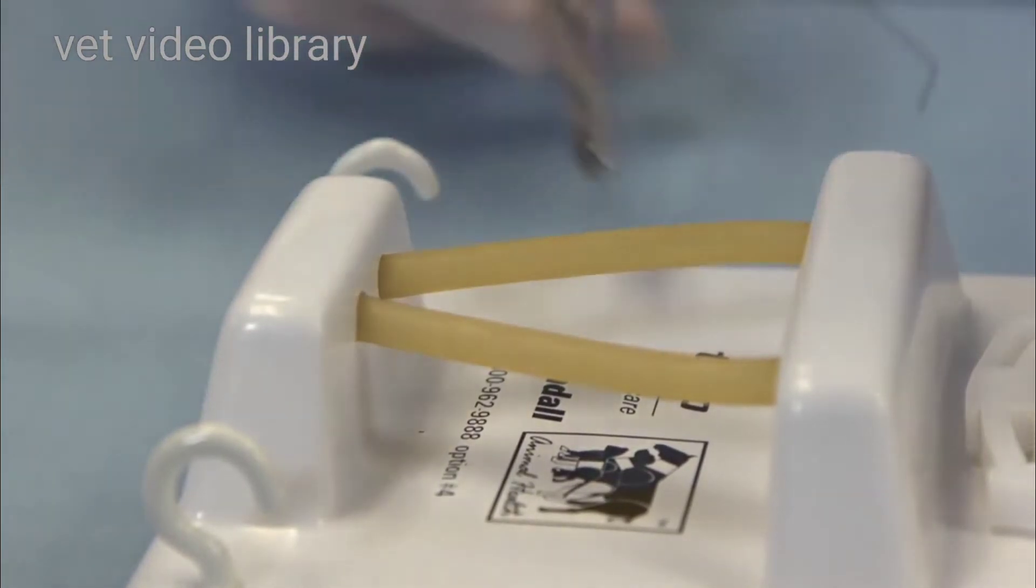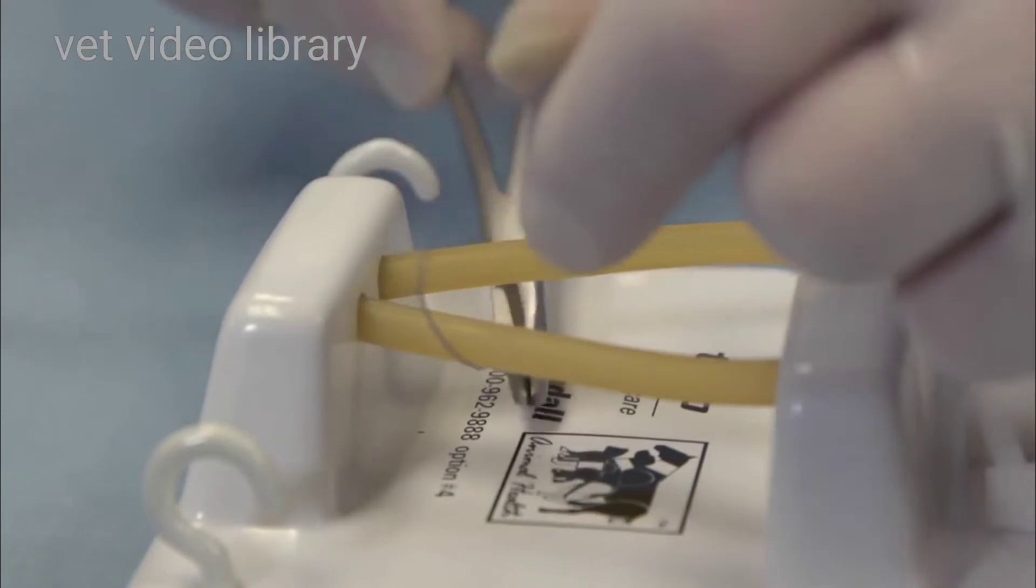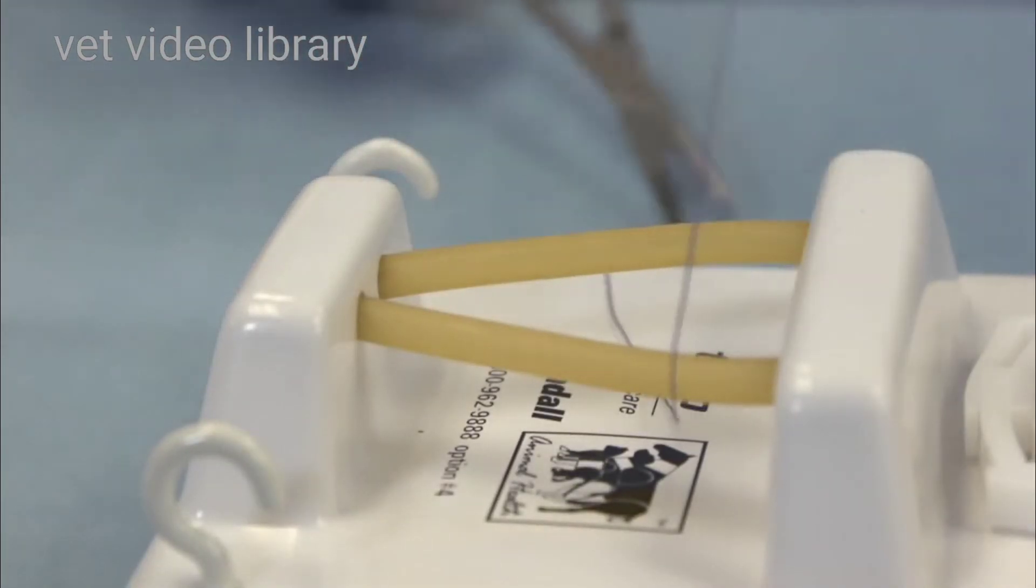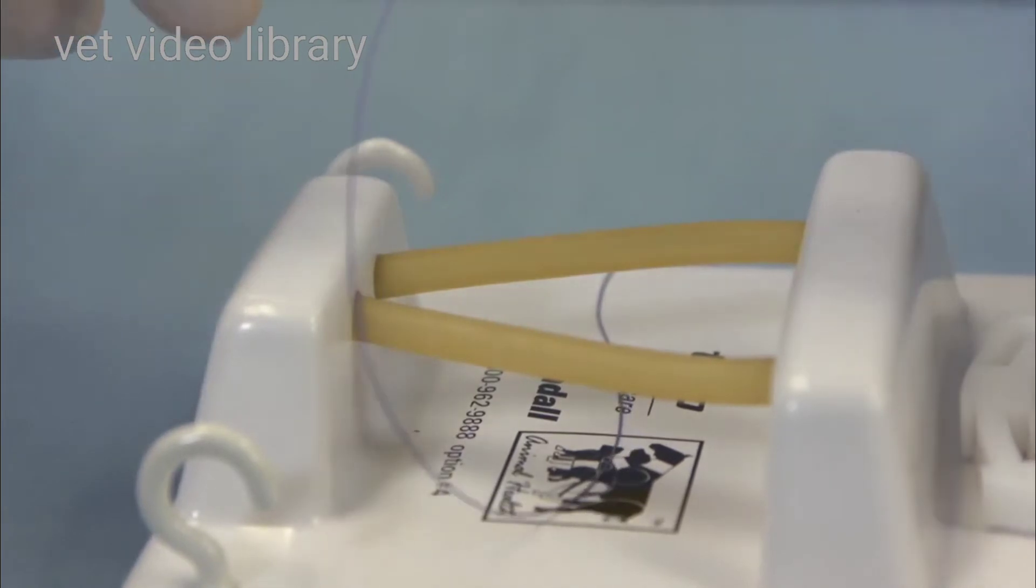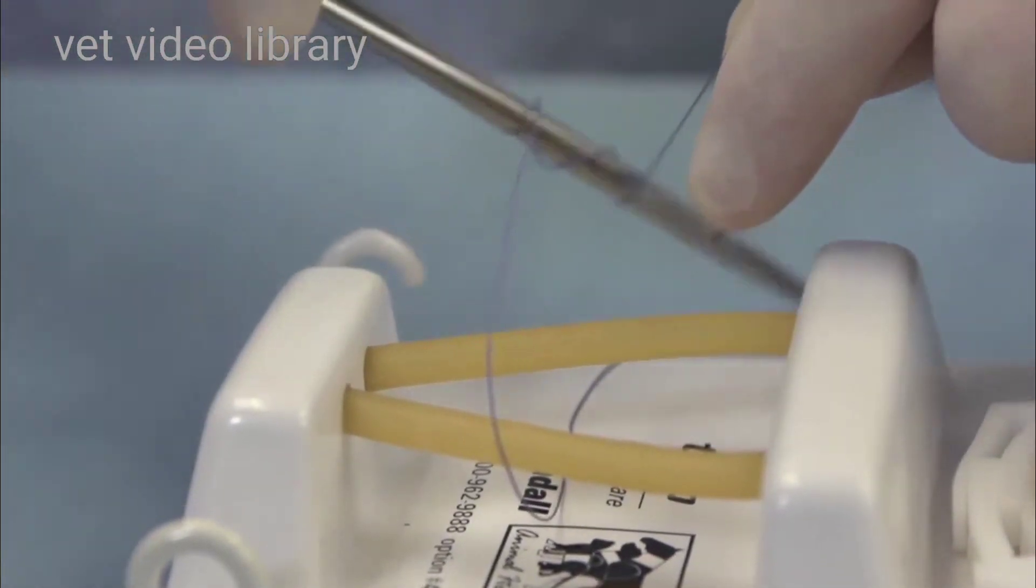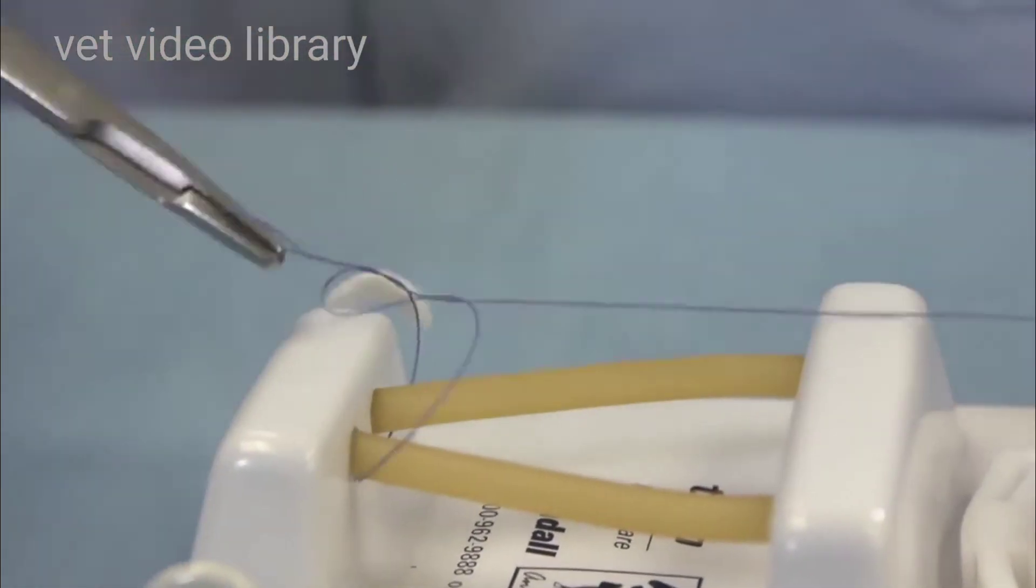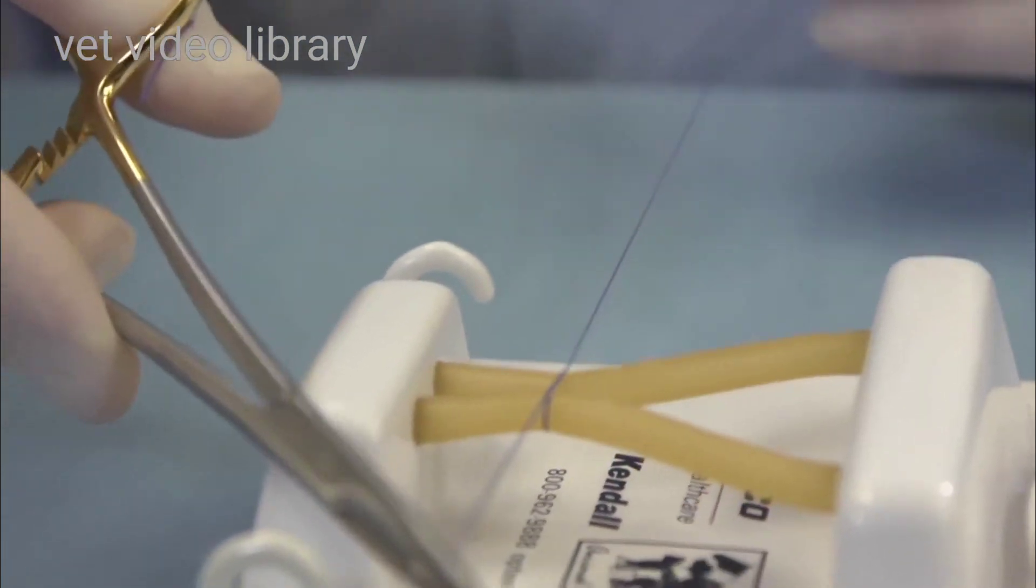Sometimes a surgeon's throw or a surgeon's knot will work. So with a surgeon's knot, we wrap the suture around the needle holder twice and we cinch it down.